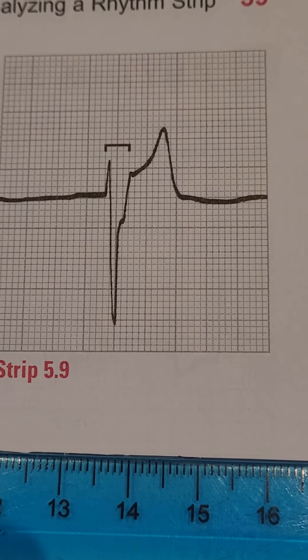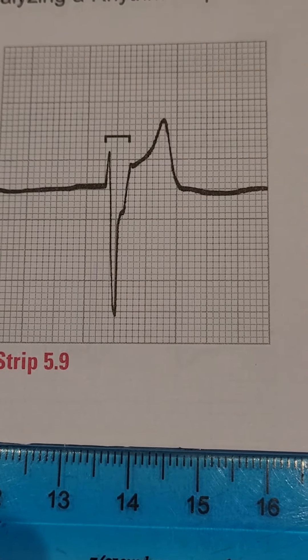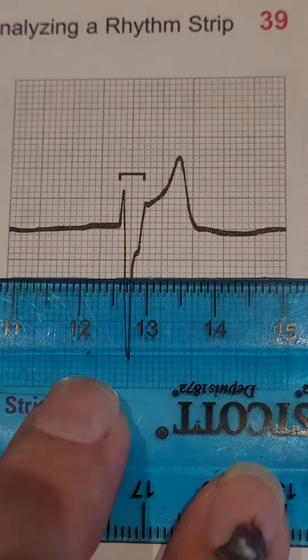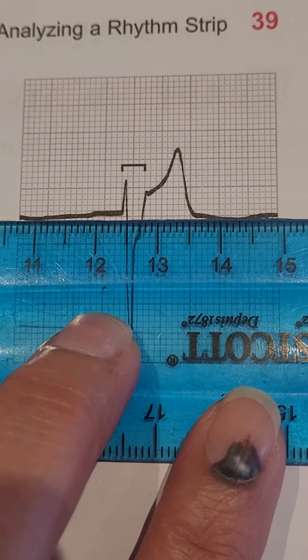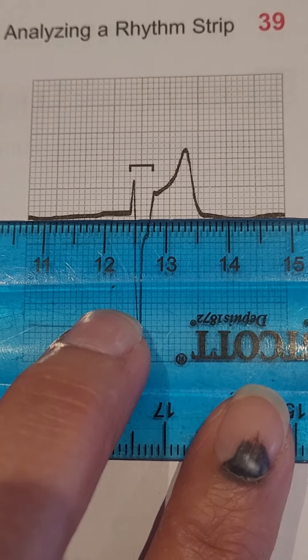Section 5.9 in the textbook — again measuring the QRS complex. Let's have a look. Finding an isoelectric line on the straight edge. So this is your isoelectric line about here. It's not perfectly straight, but it's pretty good.